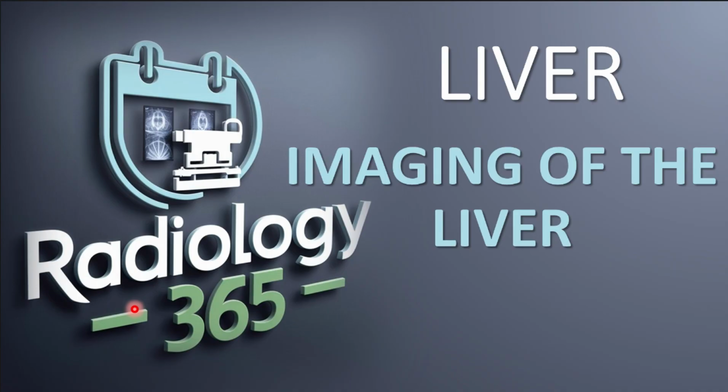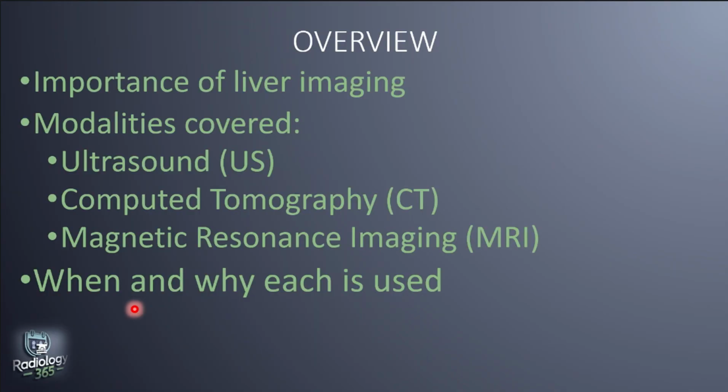Today we are going to be discussing imaging of the liver. We'll begin with a general overview of liver imaging and then dive into each modality, starting with ultrasound, moving on to CT and then MRI. Along the way, I'll highlight key indications, strengths, limitations, and clinical pearls that guide our imaging decisions.